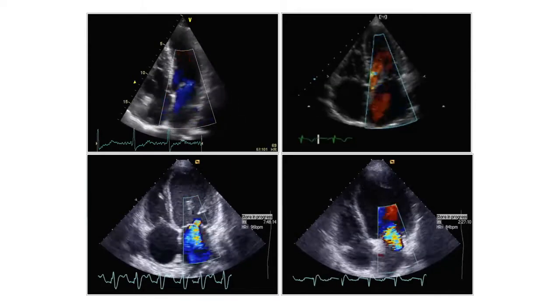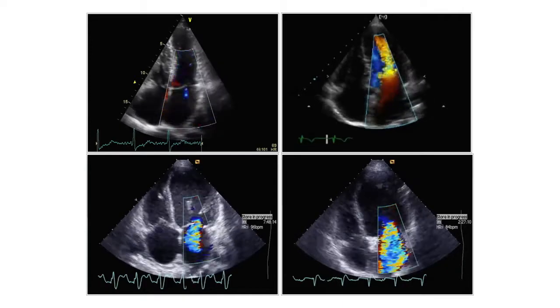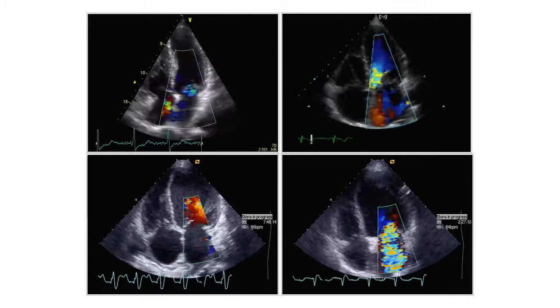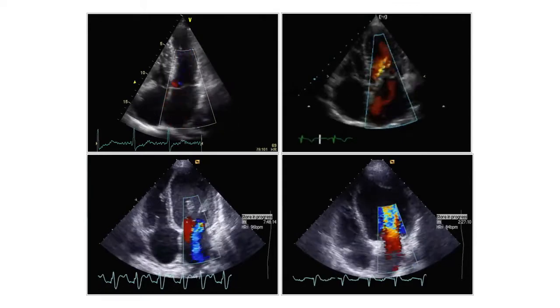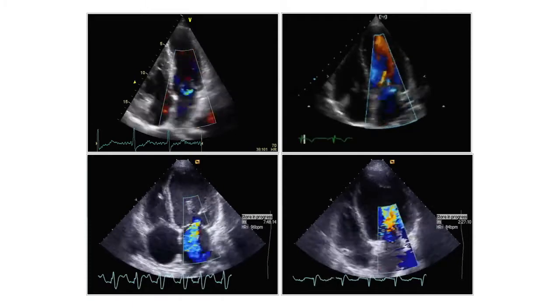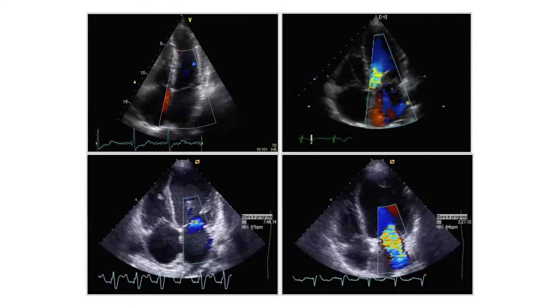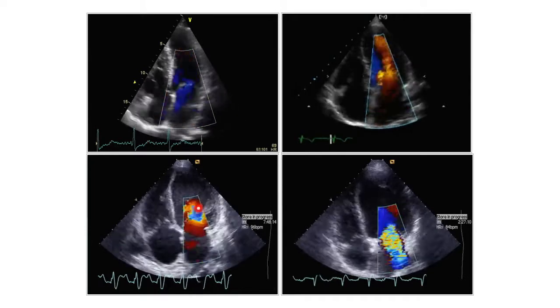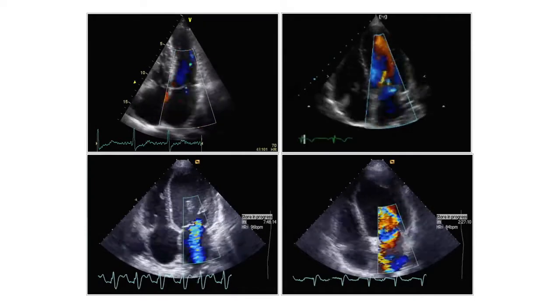Why do you think this patient has mitral regurgitation? Well, actually, this mitral regurgitation is functional and is related to this clearly compromised left ventricle. And this is the reason why also the jet is really central. Yeah, very severely dilated left ventricle, poor left ventricular function. So I certainly wouldn't want to have this ventricle.